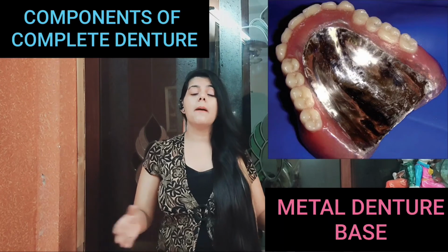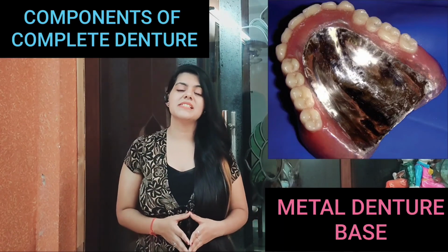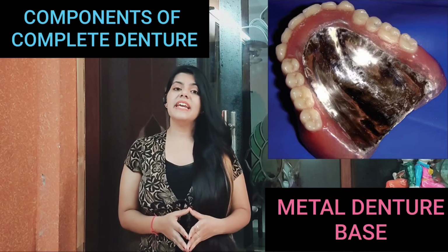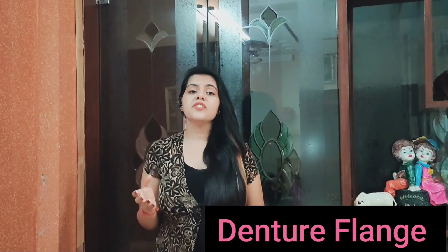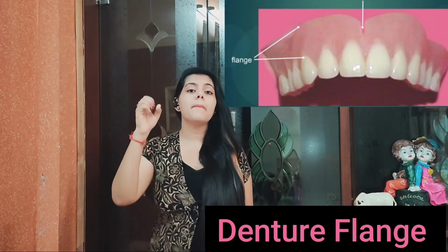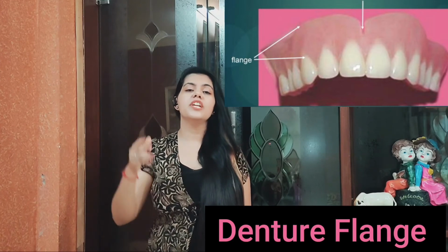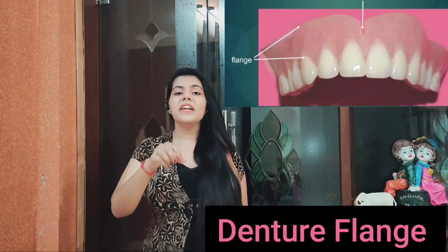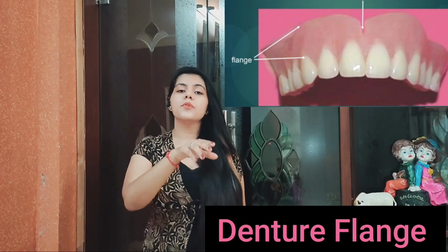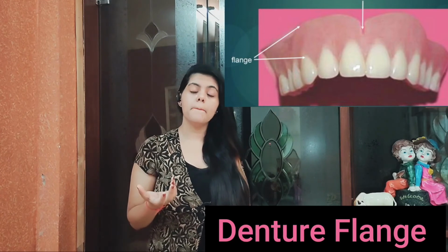So that's all about the pros and cons of the different types of the denture base. Now the next component is denture flange. Denture flange is defined as the part of the denture which extends from the border of the denture into one of the vestibule of the mouth, and depending upon किस vestibule में जा रहा है उसी vestibule के according उस flange का नाम होता है.